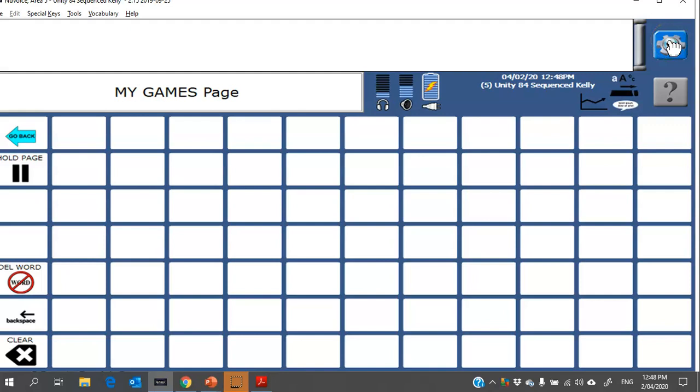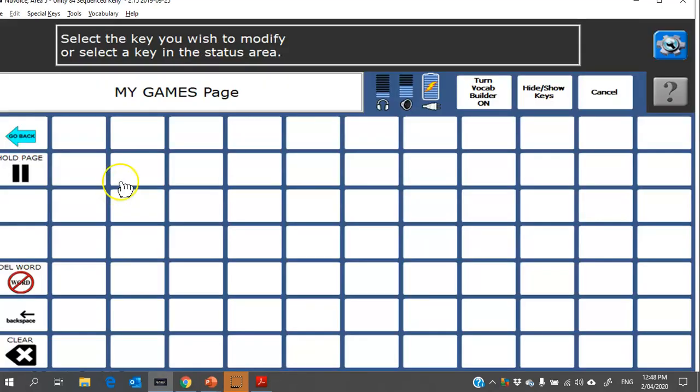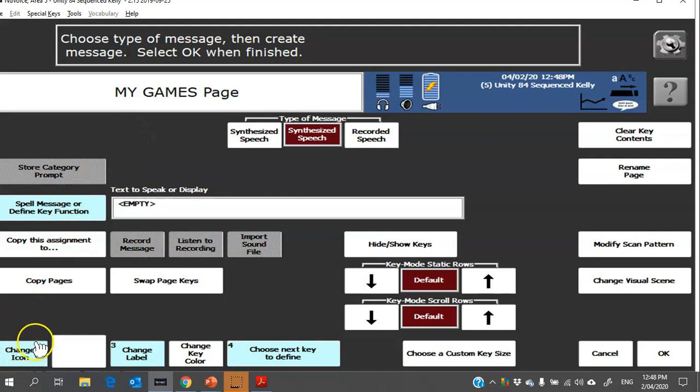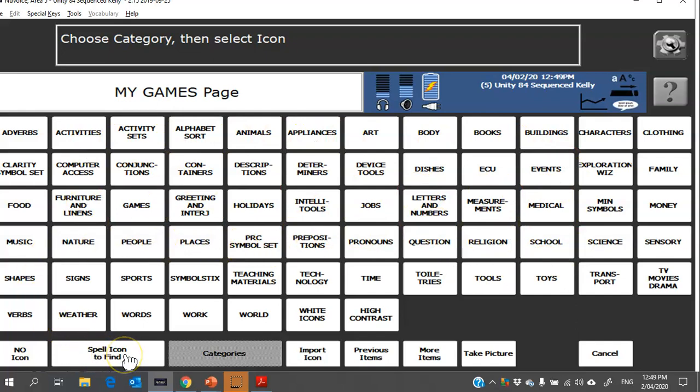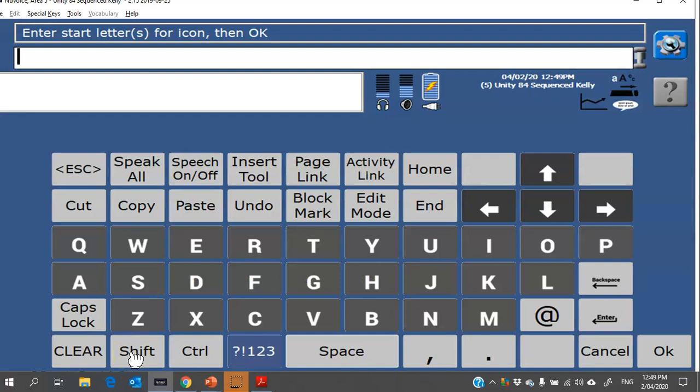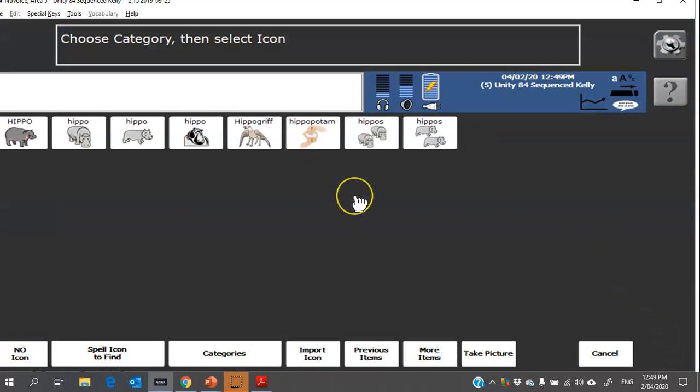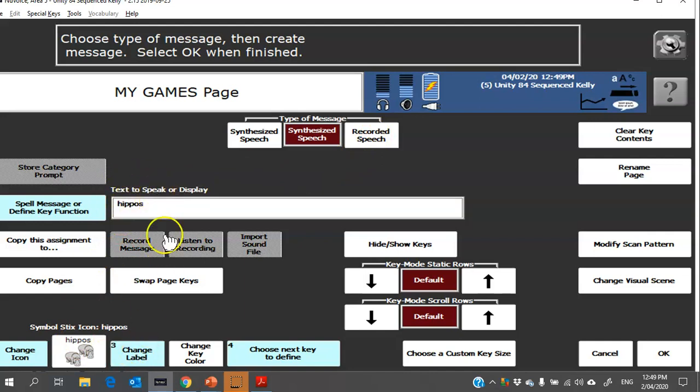So to add a word, you click on toolbox and then setup key and then choose the particular cell where you want to add a word. From here you really just need to follow these light blue icons. So the first one is to change the icon and you can look into any of these categories to find a picture, but in this case I'm going to choose to spell icon. I find that's the quickest. So I'm going to add in the game Hungry Hippos, so I'm going to type in the word hippo and then I can choose whichever one I like.